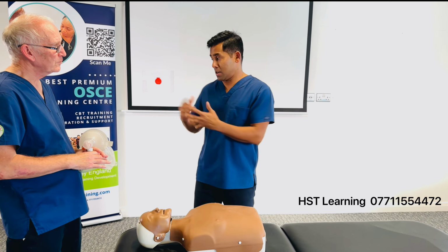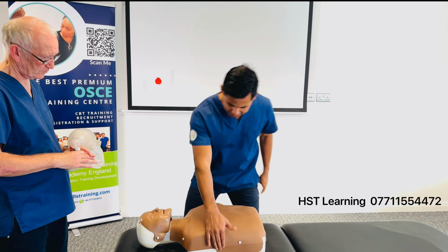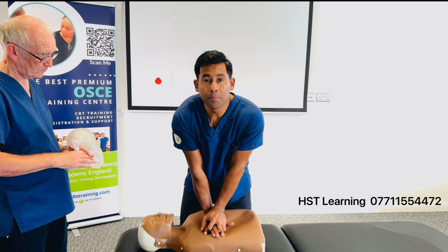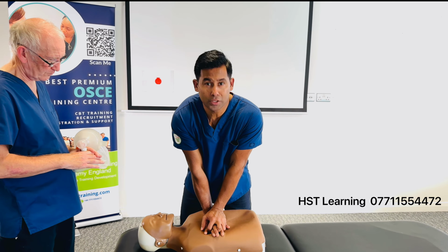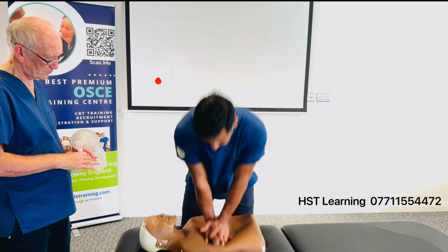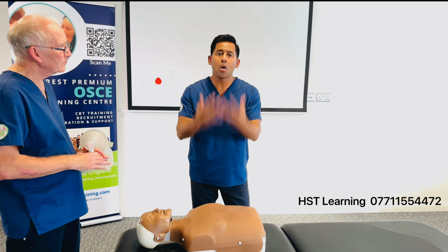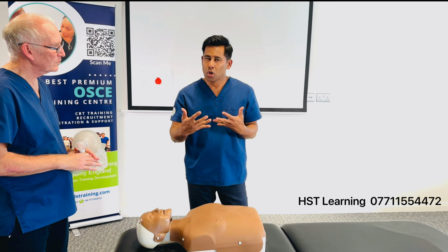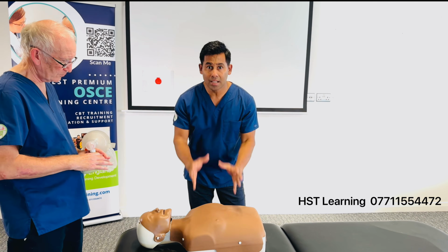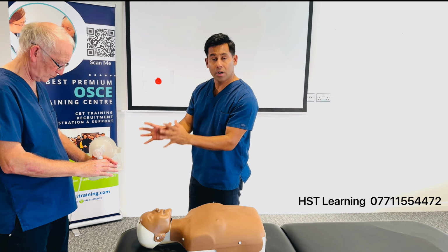So don't look at the computer. This is normally for the assessors to see. Your focus has to be to go deep and hard. Ideally, 90% of people do not meet the depth of 5 centimeters. So go hard and deep. 1, 2, 3, 4, 5, 6. Go hard and deep, and then make sure you count the rhythm. Counting helps you to stay in the rhythm. 1, 2, 3, 4. Once you're done with the 30 compressions, the ambu bag will be ready in your exam.